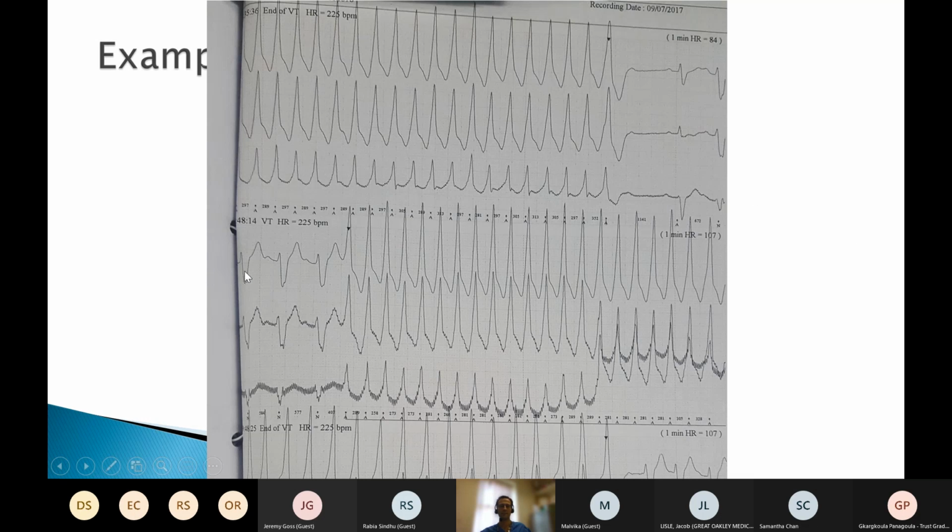So we've got an underlying broad QRS. And then we have a different morphology tachycardia. And that makes it exceedingly likely that this is VT. We can't know for absolutely 100% because all sorts of things are always possible, but we should be worried about a VT here. Now, is this sustained or non-sustained VT?